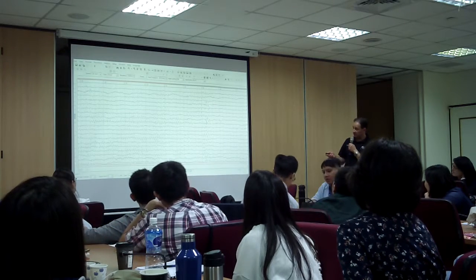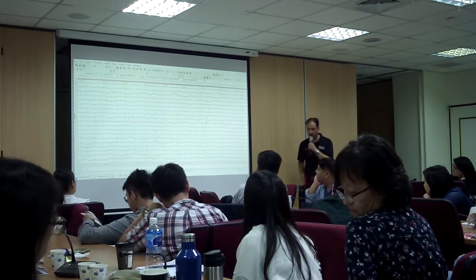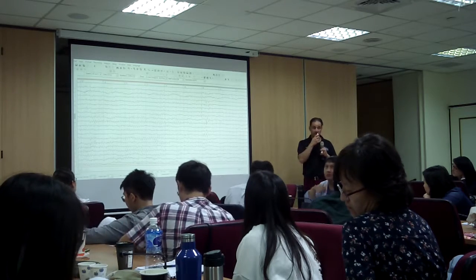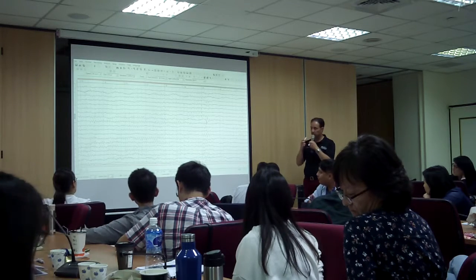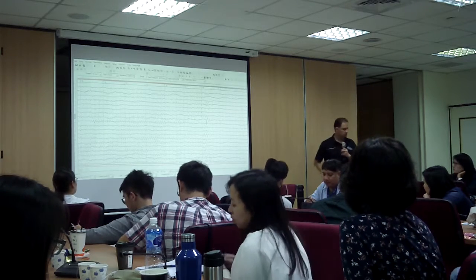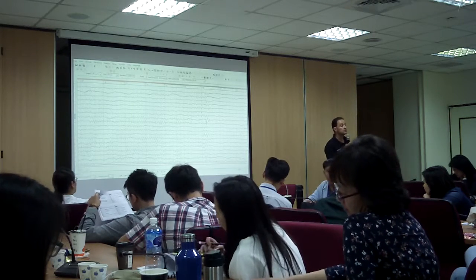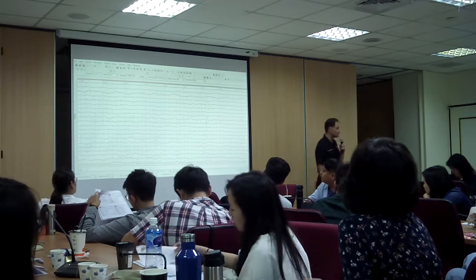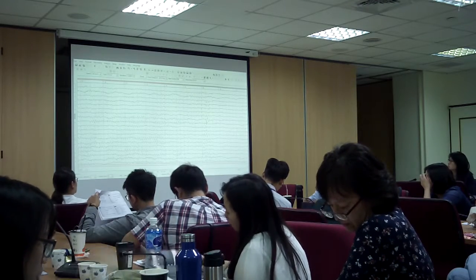Okay. So if we're seeing this pattern right here, this pattern right here, and this pattern right here, it's F7, F3, T3. What's the significance then? What could be the significance for the client? It could be memory, and more specifically, what else? Remember F7, T3, I told you was Broca's area, ABC 1, 2, 3. So what could be the significance?